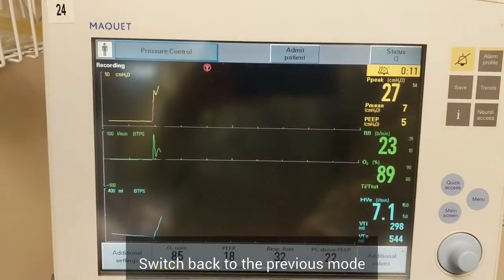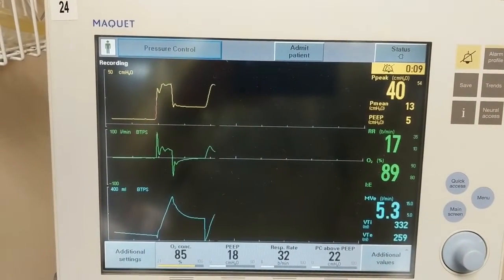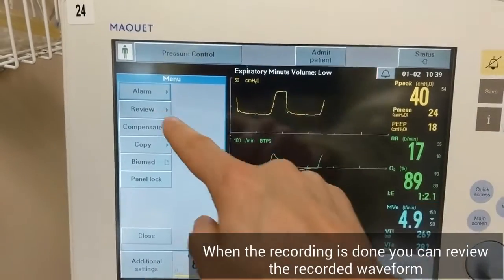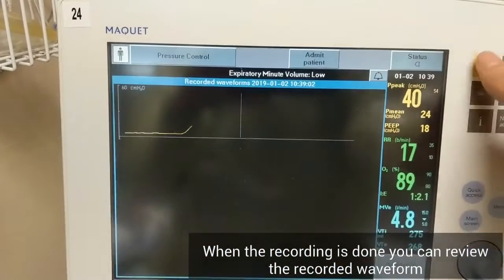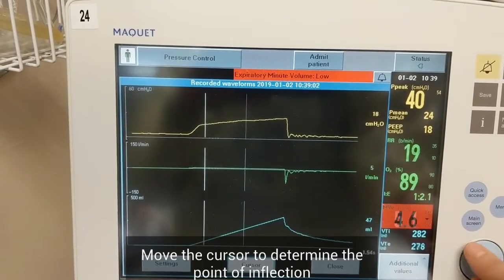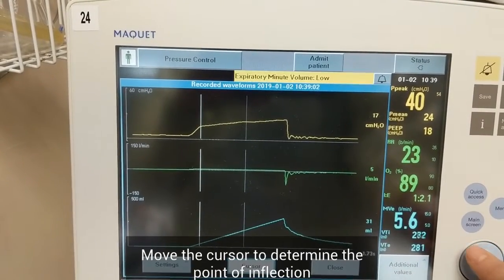Then go back to previous settings. Select menu and review your waveforms. Move the cursor along to the inflection point if you see one, and look at the pressure that is registered.